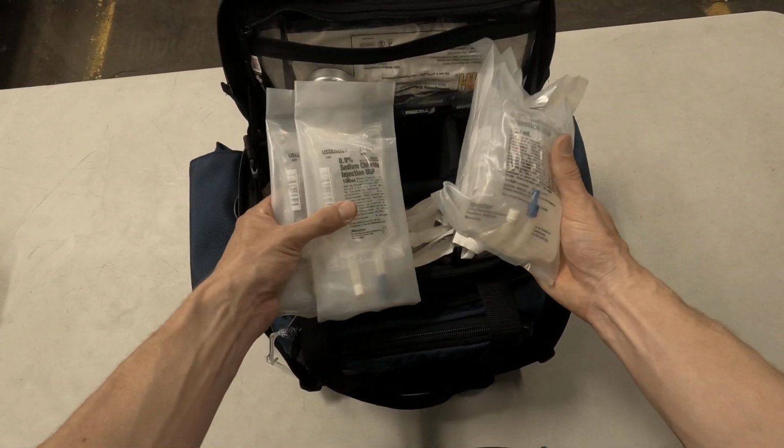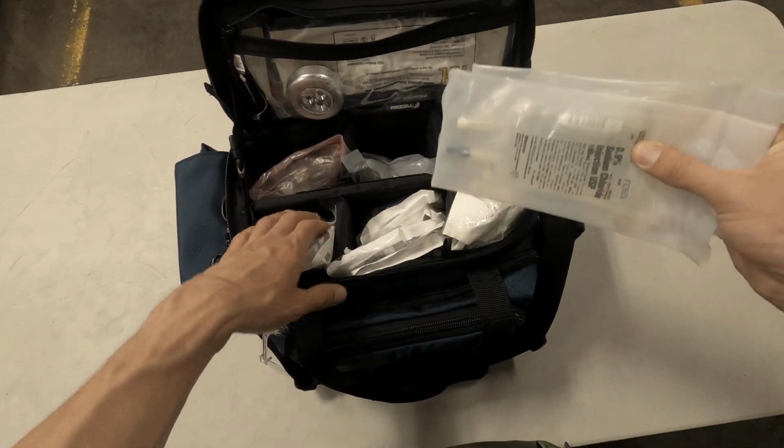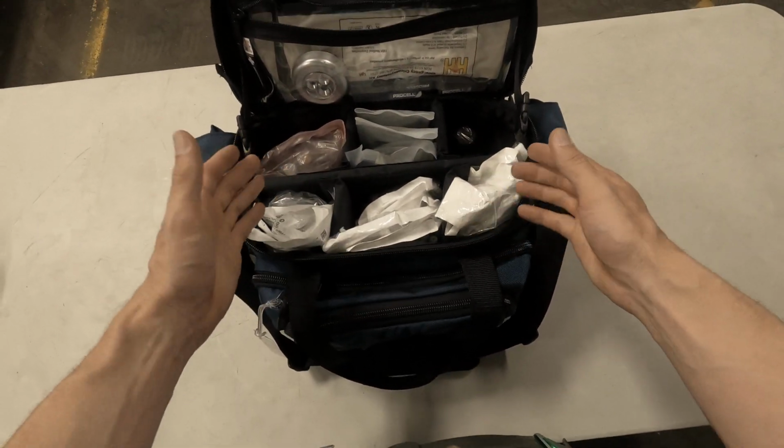So both of these items in these quantities are in the black bag. If you end up using the ones in the black bag, you can come in here and restock the black bag for critical care calls that you do later on in the day that you need the first in bag for.